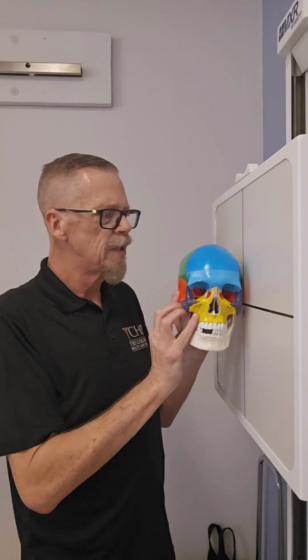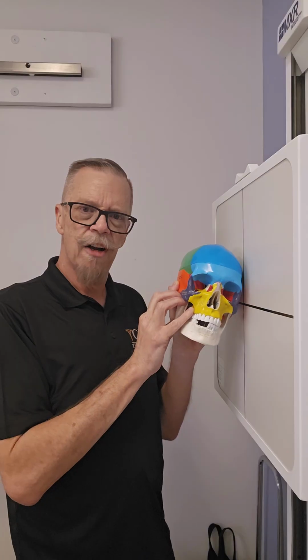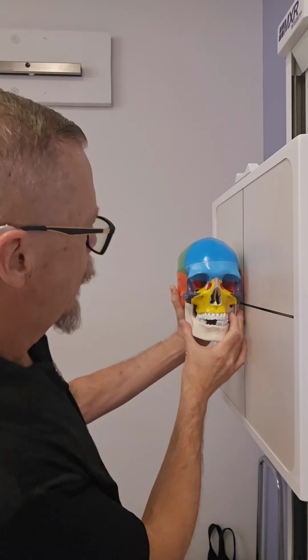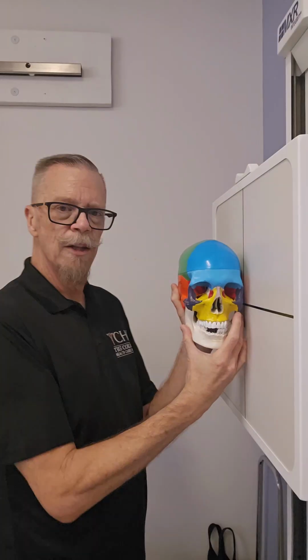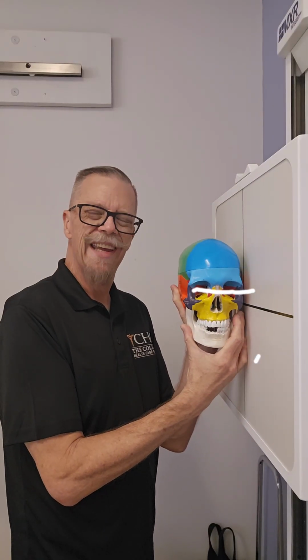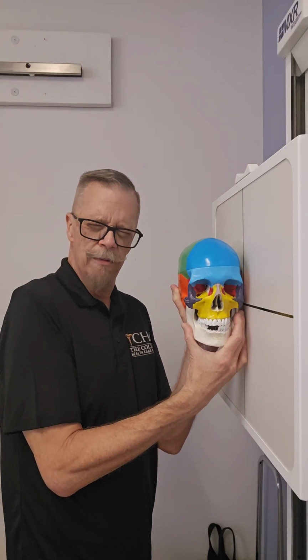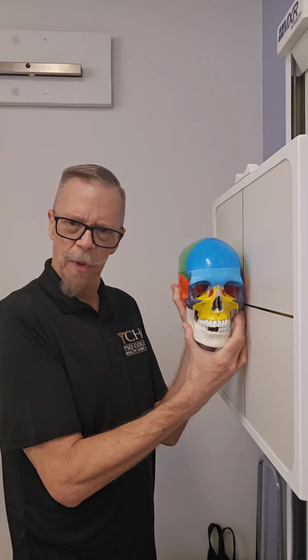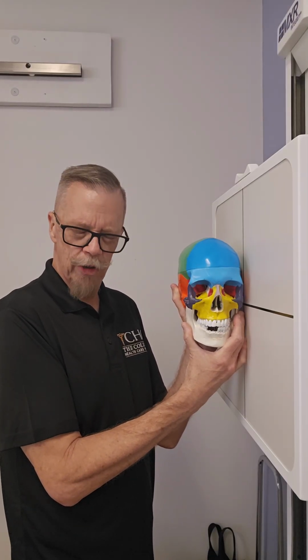You see, obviously there, it's tilted. That looks pretty straight to me. Again, it's a little difficult with the skull instead of an actual human, but that's how we would want it for a lateral skull pretty much. So those are the positioning lines, the main ones that we use.